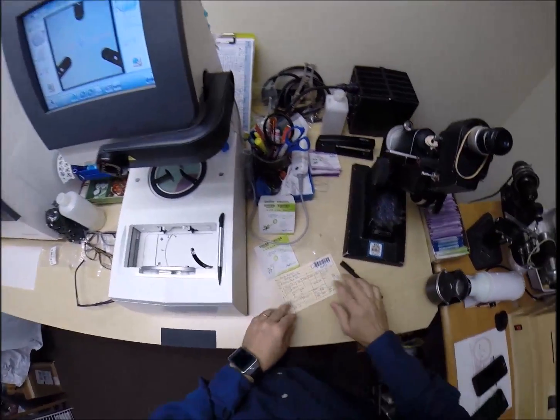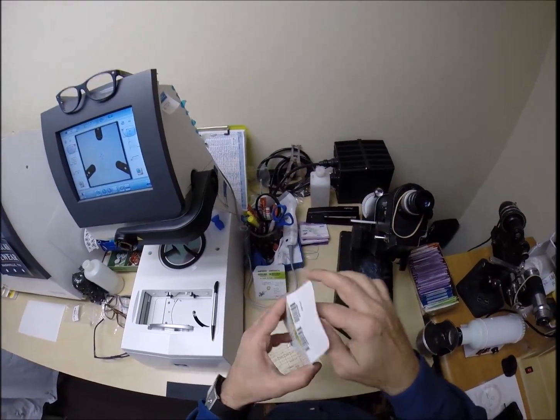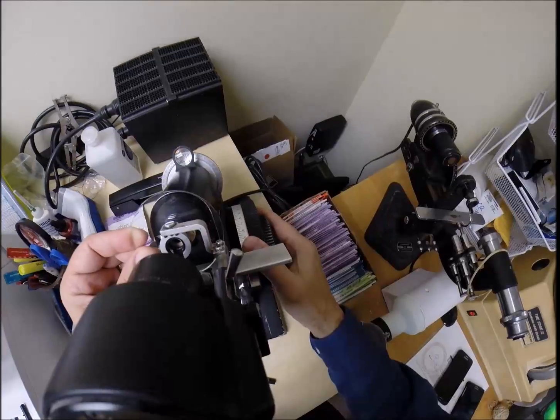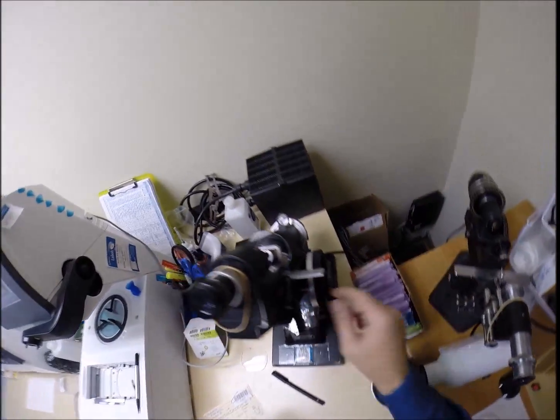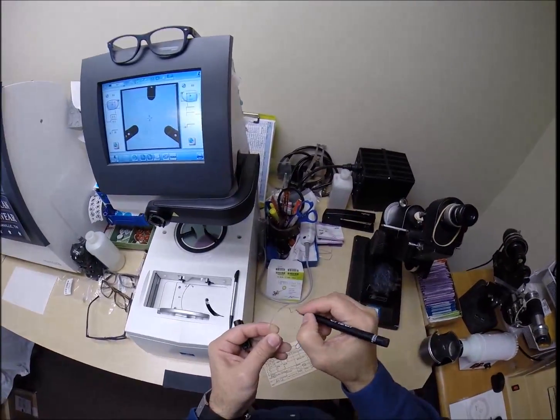I'm going to do the same thing now for the left, which is plus 75 sphere. You only need magnification. I'm going to have to turn the power drum to plus 75, and I'll check that for you a little bit later. And again, I'm going to put one dot in the center. And this is the left lens.